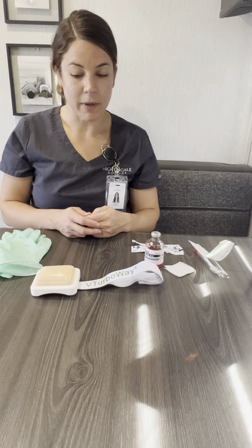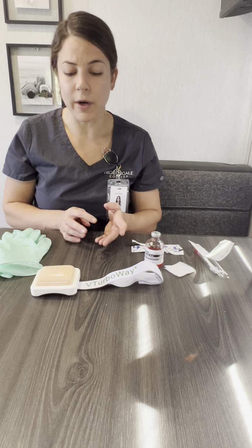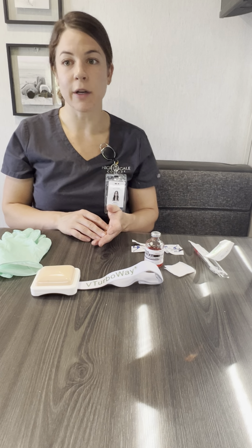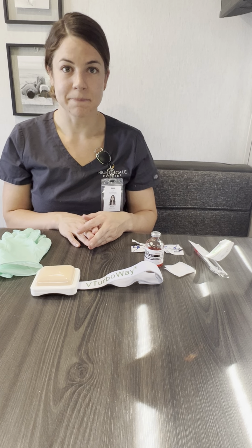I am here to administer a tuberculin skin test. All that's used for is to decipher whether or not you have the antibodies or an infection of tuberculosis. If you do, you'll follow up with your doctor and they'll take it from there, but this is just a test we're going to administer. Do you have any questions about that?